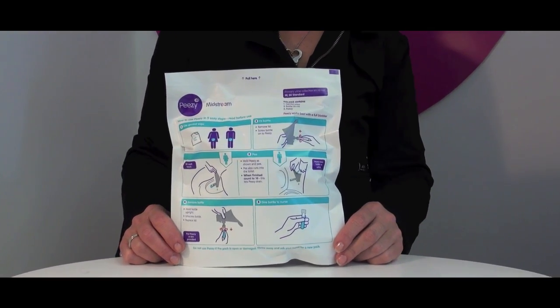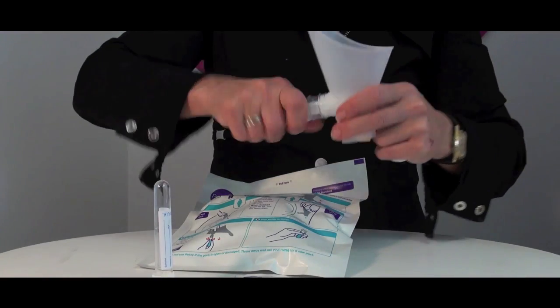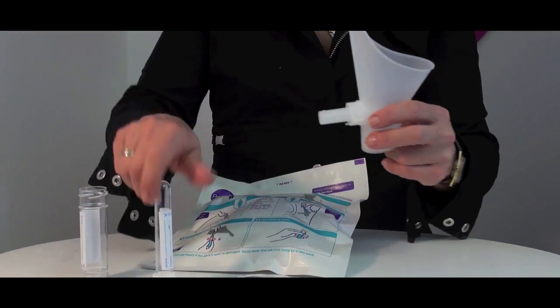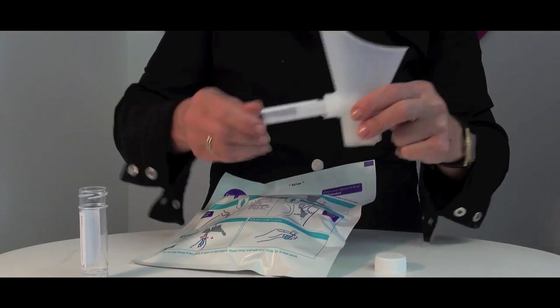The really belt and braces method of providing an MSU is to clean yourself with a genital wipe first. This is provided in the PZ kit. PZ works with the standard universal container, with a 10ml primary tube that fits into most automated laboratory analysers, which means no decanting in the lab.